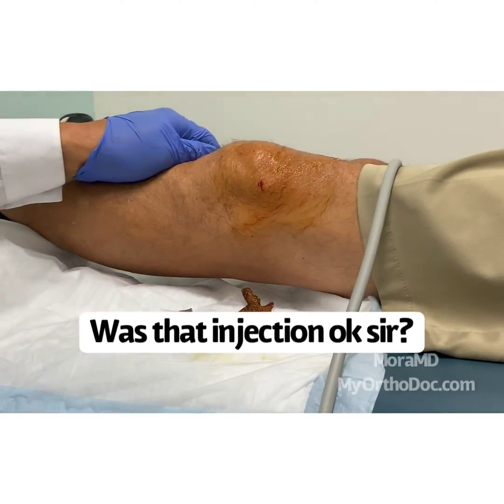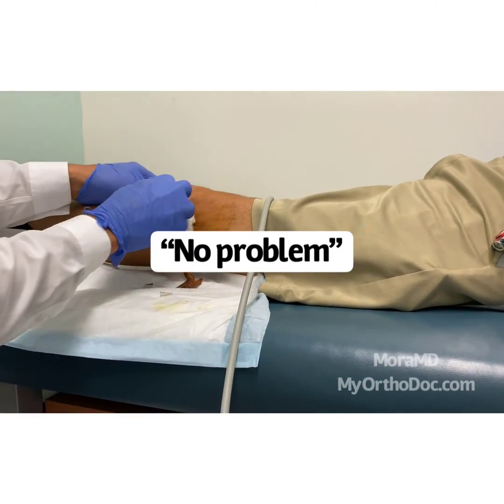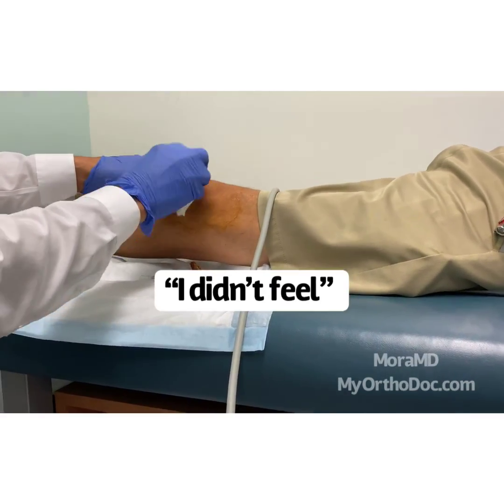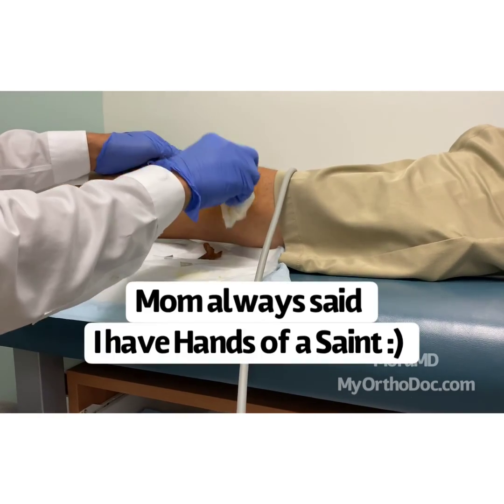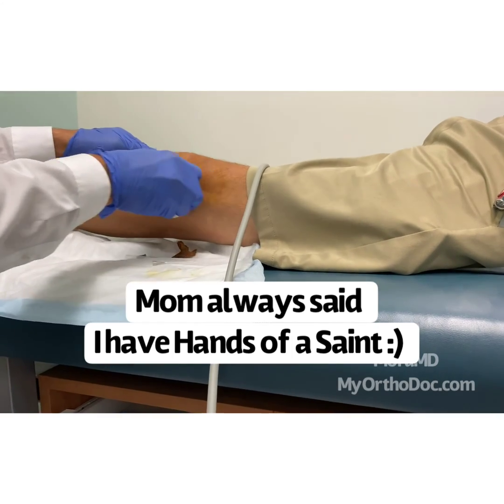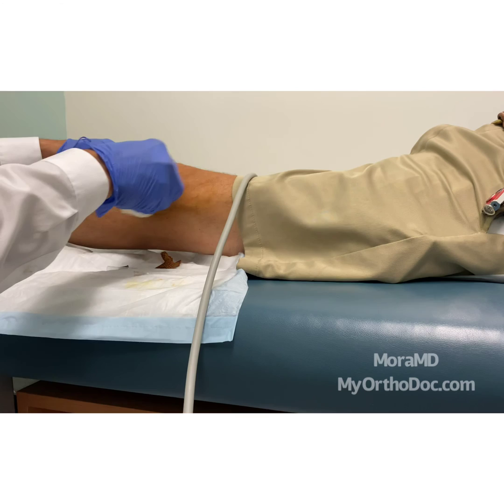Was that injection okay, sir? No problem. How much did it hurt? Did it hurt very much? Okay, you felt the poke initially. Oh, I didn't feel a thing! Good. Well, you know, my mom always said I have hands of a saint. Oh, I can tell — you're too kind. Thank you so much for allowing me to record this.